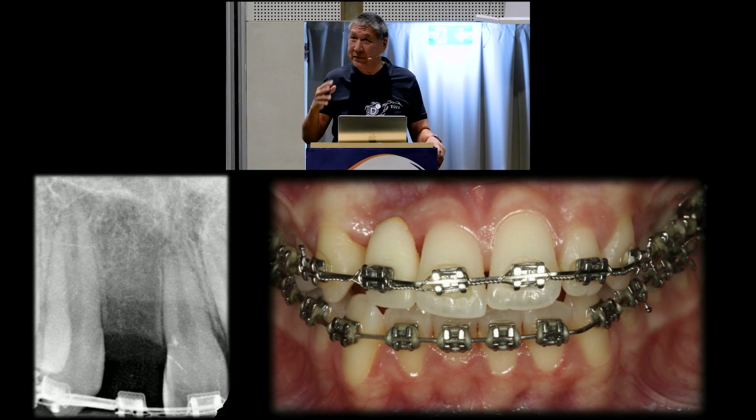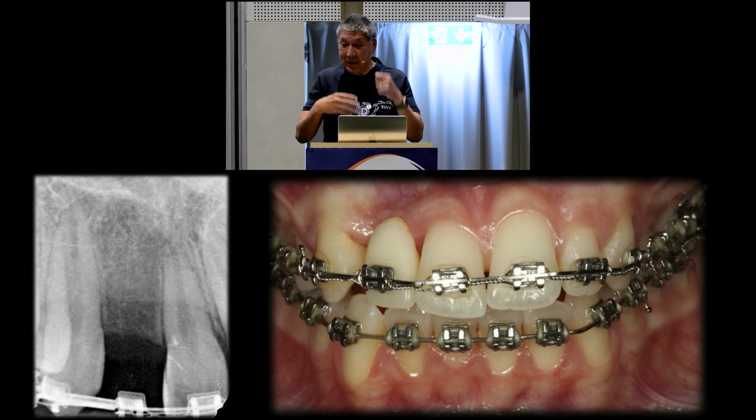She's actually only 15 years old, so we're not going to place an implant now. We're going to wait until she's fully grown, but we want to set up her case properly. He said the problem here is that there's too much space, and he would rather get the teeth in the right position, and then it would help him with implant selection later on as far as dimension.